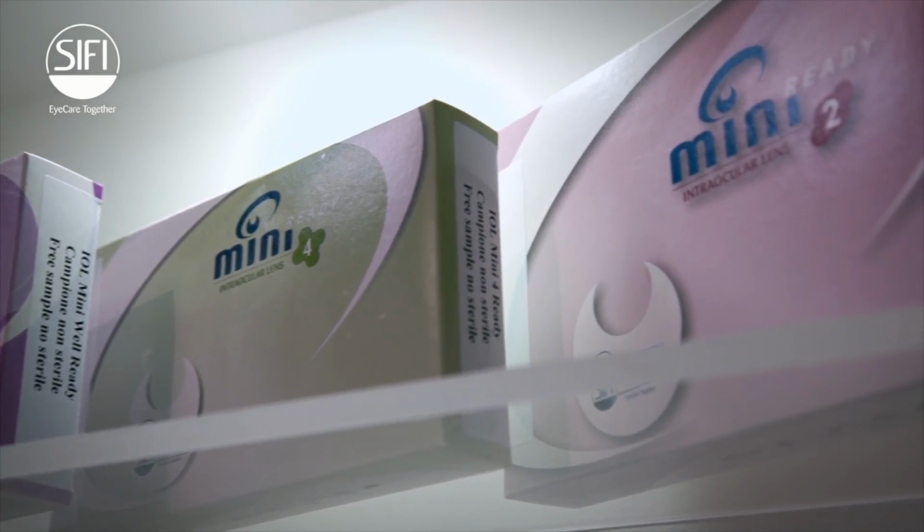What we can do is to perform a surgery with a progressive intraocular lens, which means that the patient sees very well from far, from computer, medium distance, and only for very, very near needs a +1 lens.